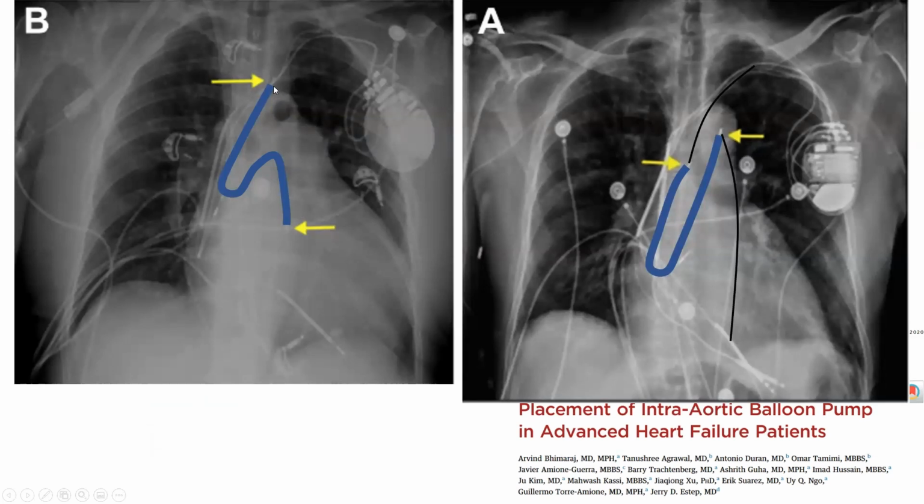The proximal marker may not have moved. It's the distal marker that moves. You see that the distance between those two markers has shrunk. That's your indicator. So look here. This is how it looks without me annotating it. You see this? And you see that. This is much higher. Well, what happened here, you can trace it in your brain. This is what's happening. Okay?